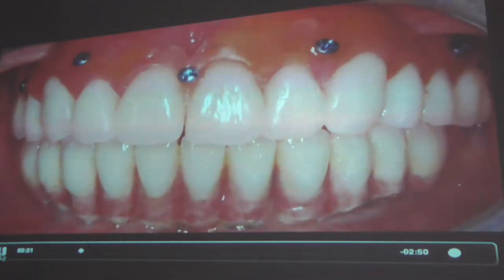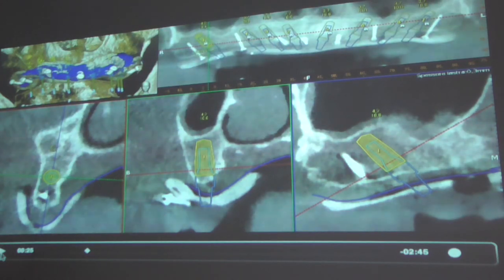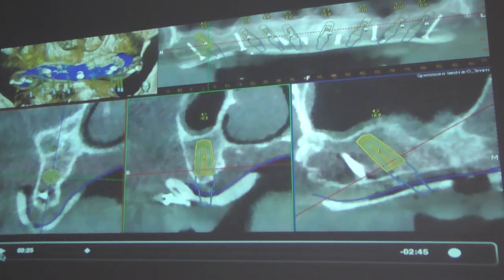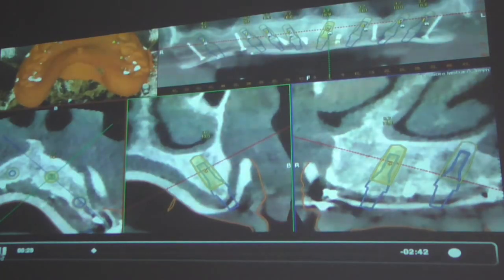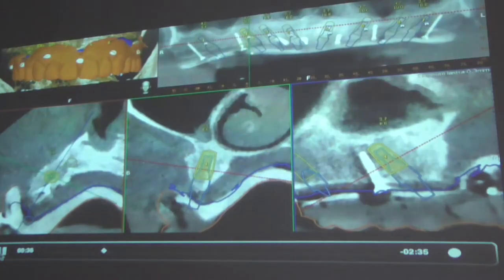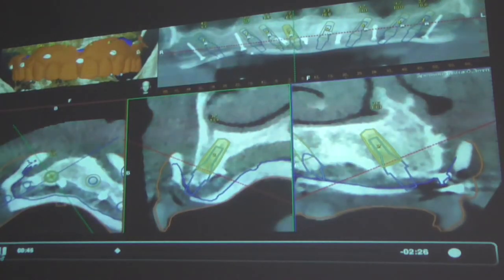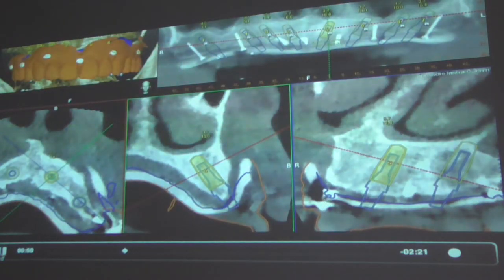In order to get the intraoral scanning and match it inside Navident, what I get is the planification. With the conometric connection, all implants are planned parallel. I take my time to place the implants correctly — they are all parallel within two degrees each implant. It doesn't look parallel in the panoramic view, but I assure you they are. I import the wax-up and match it with the bone screws because I can see it on Navident. Then I plan all the implants and even the abutments, so I can tell the lab the height of the abutments — they are all straight.